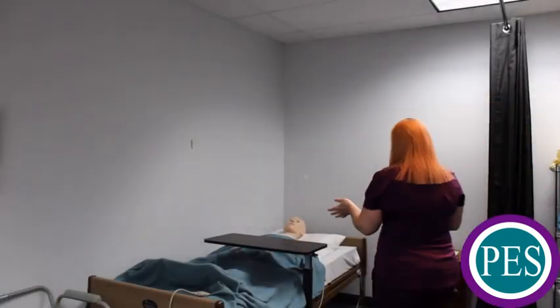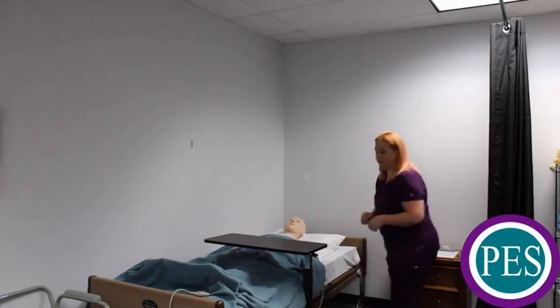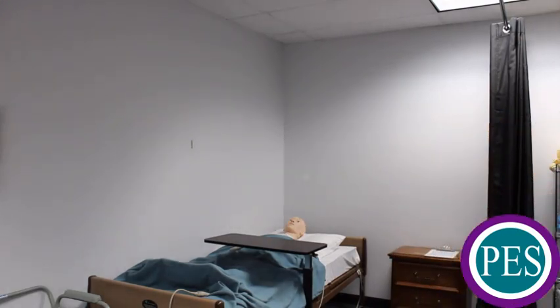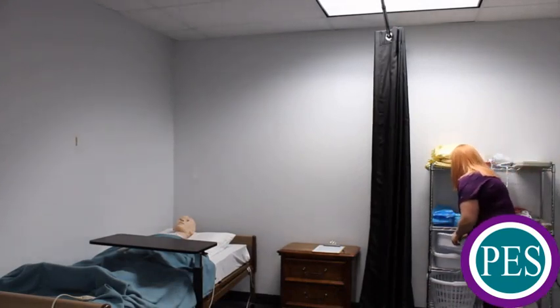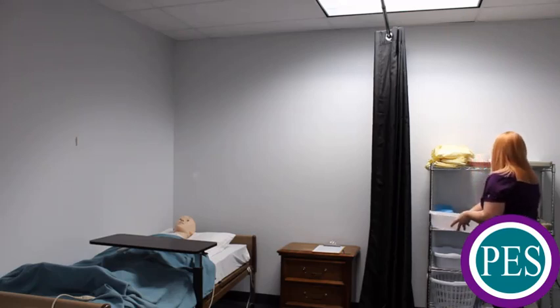Explain the procedure to your resident. Maintain respectful and courteous interpersonal interactions at all times with your resident. Collect your supplies. If you're curious about what supplies are needed for this task, it's listed at the very beginning of this video.